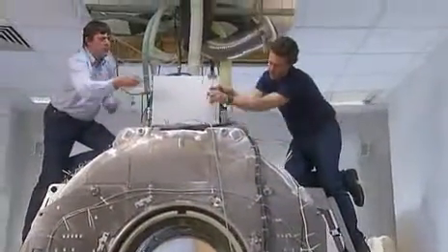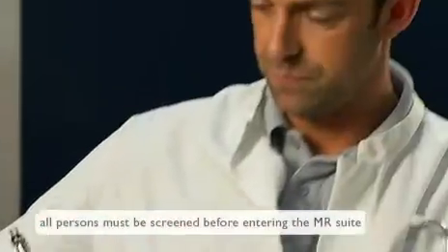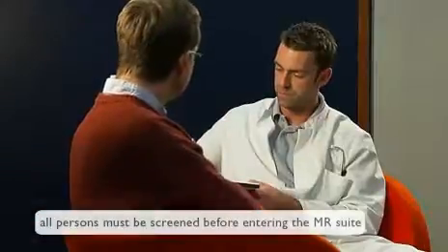Remember that these guidelines are not only for patients and medical staff, but also for cleaners, service engineers, medical and non-medical emergency personnel, including firefighters, and anyone else who might possibly enter the MR suite. Screen everyone for ferromagnetic objects in their bodies, such as implants, bullets, and shrapnel. And screen everyone for metal on or attached to their bodies, such as hairpins, brassieres, buttons, zippers, jewelry, and body piercings.